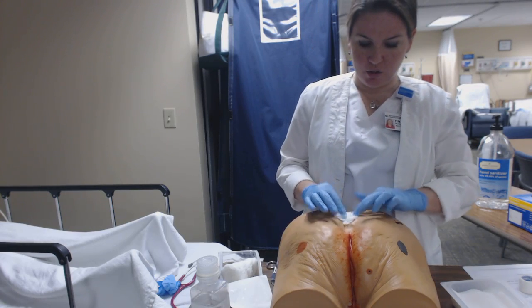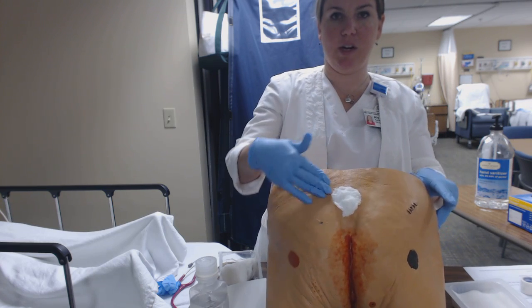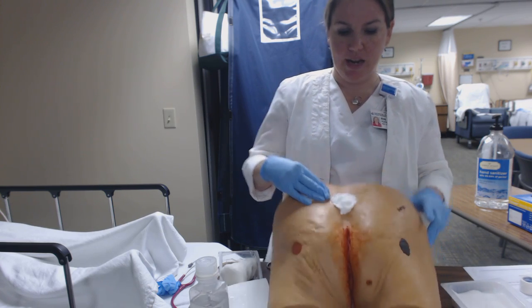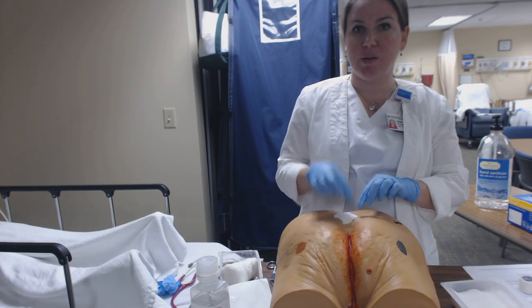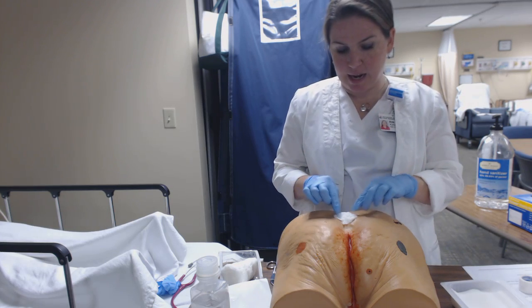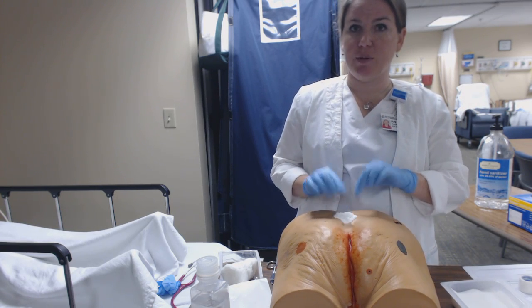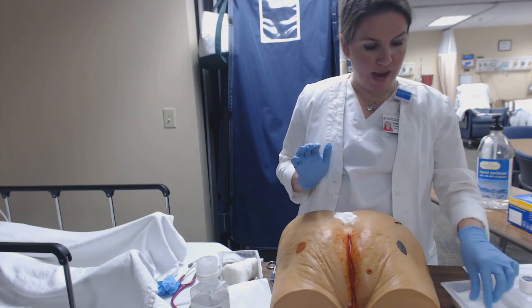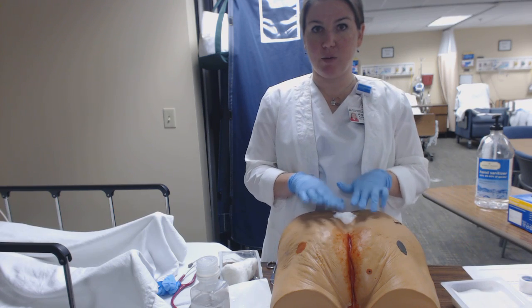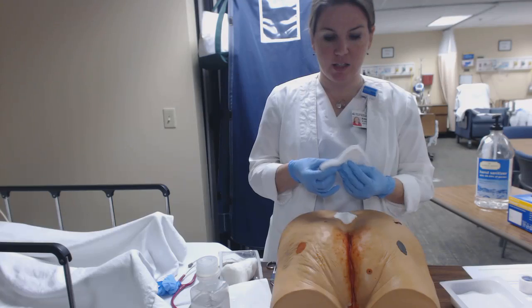Not a sterile wound. So you guys can see there that my dressing is covering all of the wound bed. And our little tunnels were kind of teeny tiny, so as I was packing in there, which I should have explained, I was kind of pushing down in that area a little bit to make sure that I was including them in the packing. So our wound has been packed, so that's the wet gauze. And now I'm going to do the dry gauze.